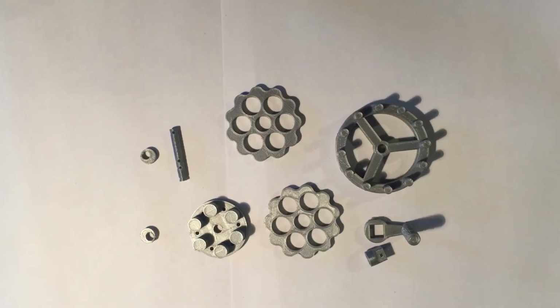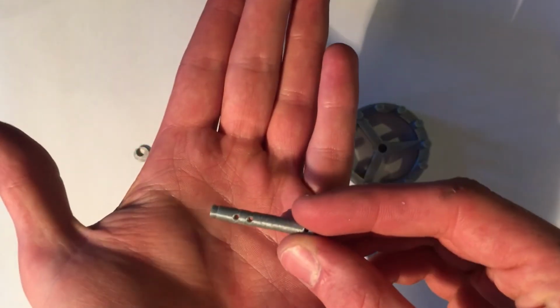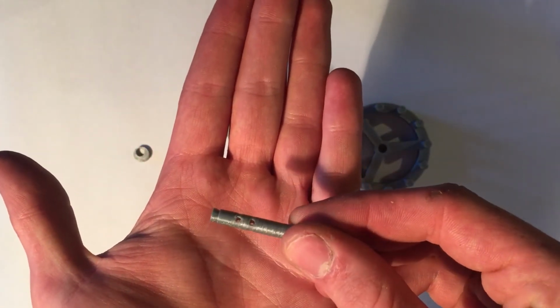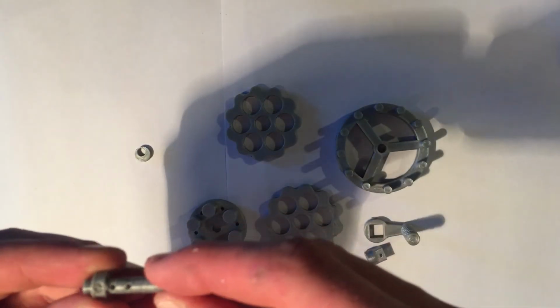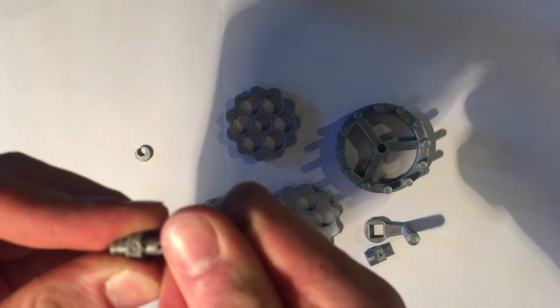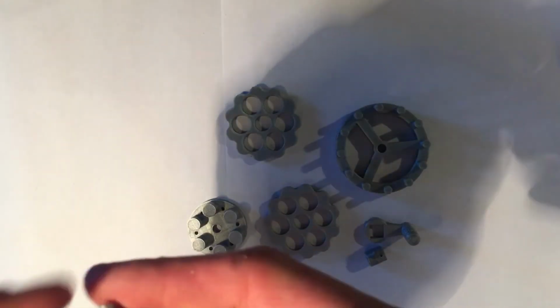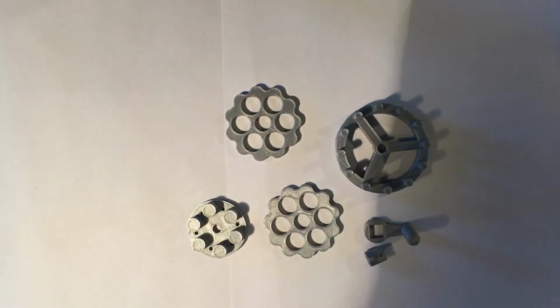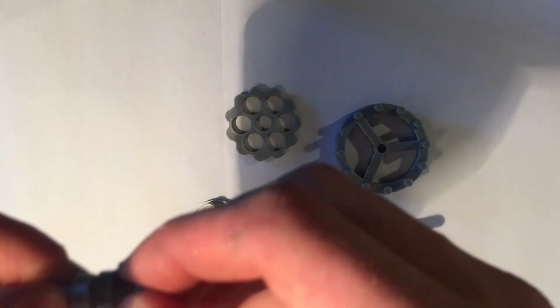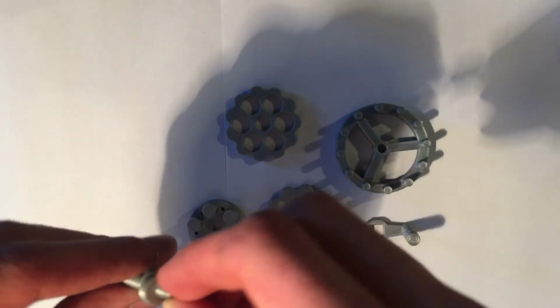So here we have all the pieces lined up on the table. Here you can see the little shaft and it has two holes in it. We need to align the off-center cams on these two holes. And the special thing is, they must be 180 degree opposite. That makes the whole thing stabler and less wobbly if we spin it fast. What's not the case with this model, but will be with our final product.